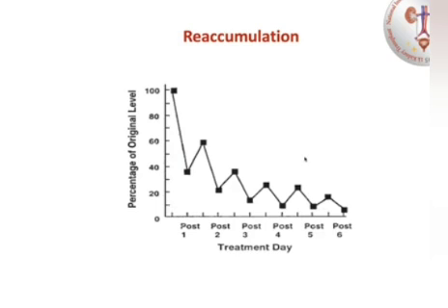And that's why in most of the cases where we perform plasma exchange, most of the protocols say that you do the first 5 sessions on consecutive days, sometimes the first 3 sessions, sometimes the first 7 sessions, according to the substance. And then you go after that every other day if you still need this technique.